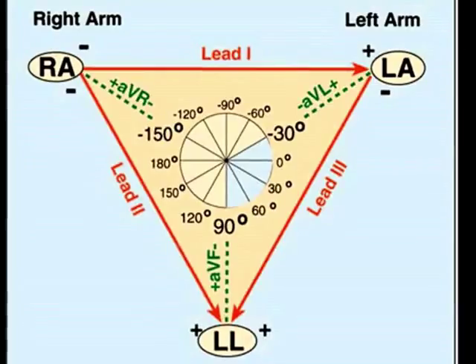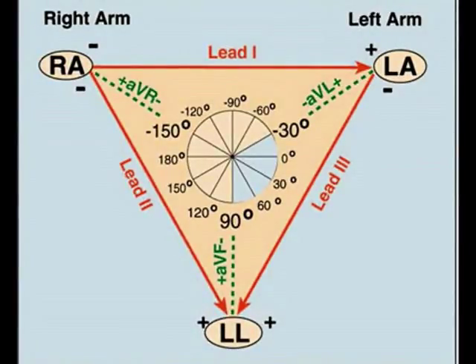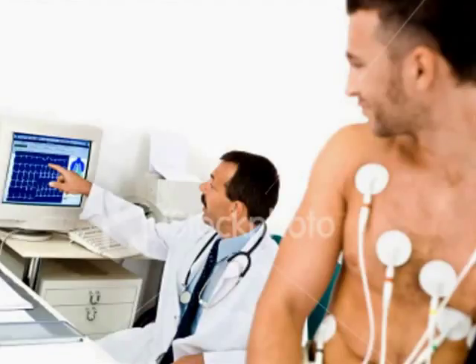So, now we're going to talk about the functions of the ECG. The function of the ECG is to monitor the patient's heart rate. It evaluates the effects of disease or injury on heart function. It evaluates pacemaker functions, as well as evaluating responses to medications. So, in that aspect, it is quite imperative that we obtain baseline recordings before, during, and after the procedure.